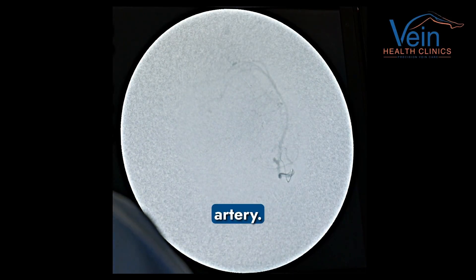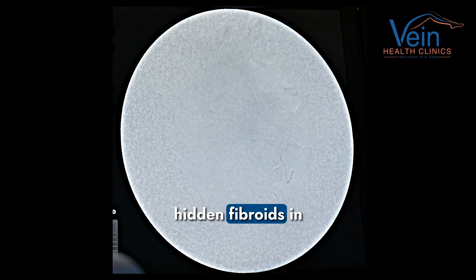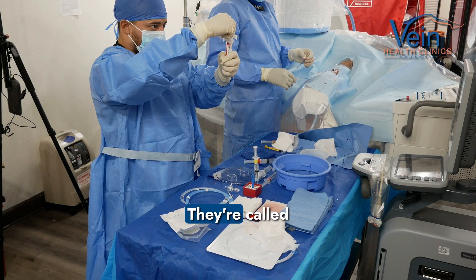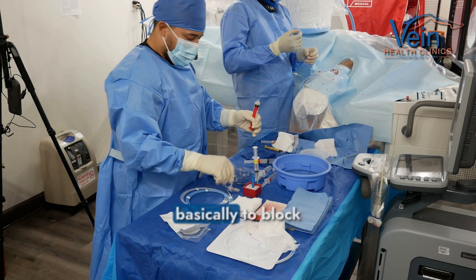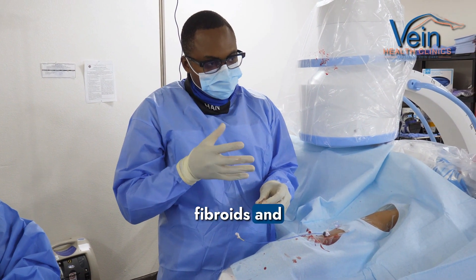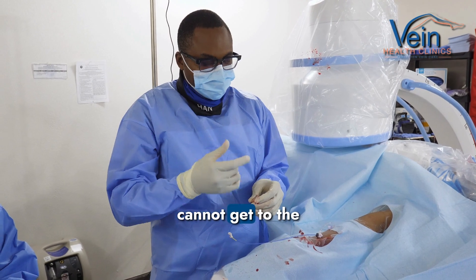And there it is — that's the uterine artery. What you can see is that there's a big vessel feeding fibroids in the superior aspect of the uterus. Once we've identified the fibroids, we're going to start injecting these particles. They're called embospheres. The function of the embospheres is basically to block the capillary network of the fibroids and go really deep into those fibroids.